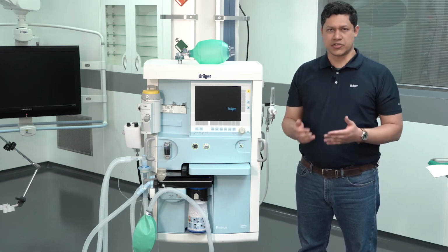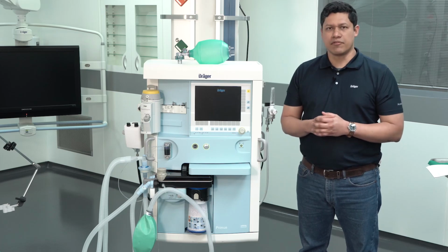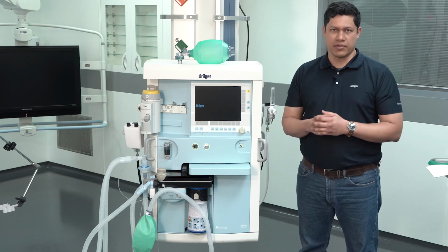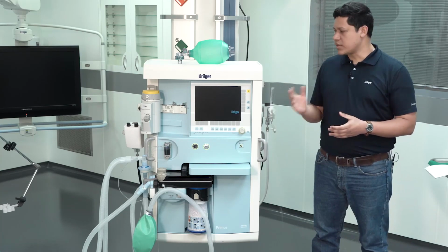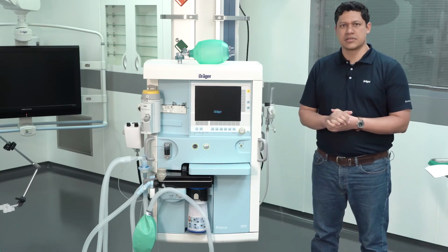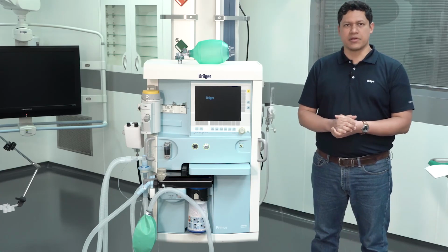Make sure an experienced user, for example an anesthesiologist, is available to you always, 24/7. In case of any problem, call for help at an early stage. Before connecting the patient, verify the readiness of the systems and accessories. More details on how to do that will be explained later in this video.